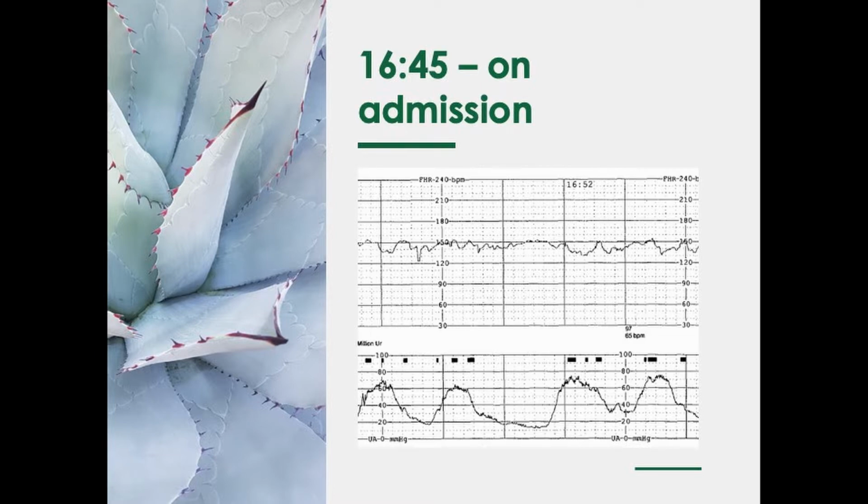It's 2 minutes on average, and those 2 minutes that you take to determine fetal heart rate do not need to be continuous. So you can have a 1-minute stretch and a 1-minute stretch. You're looking for the relatively flat parts over about a 2-minute stretch. So probably around 145 here.